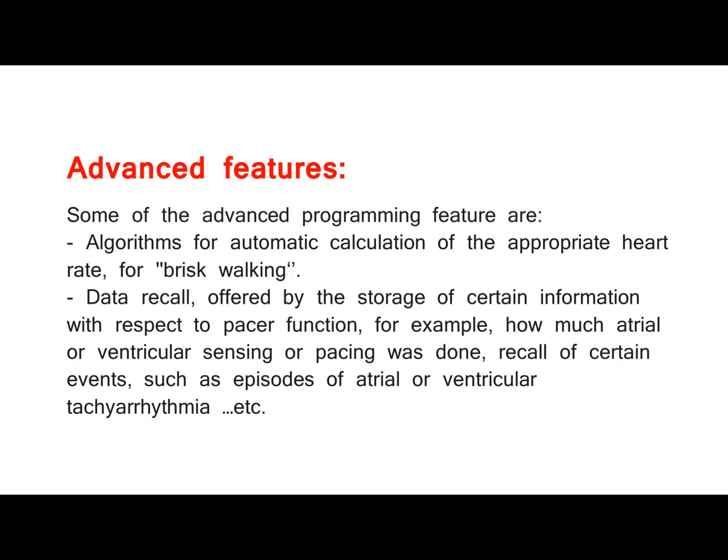Advanced features. Some of the advanced programming features are algorithms for automatic calculation of the appropriate heart rate for brisk walking. Data recall, offered by the storage of certain information with respect to pacer function, for example, how much atrial or ventricular sensing or pacing was done, recall of certain events, such as episodes of atrial or ventricular tachyarrhythmia, etc.